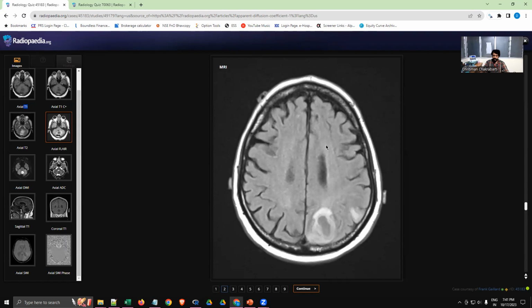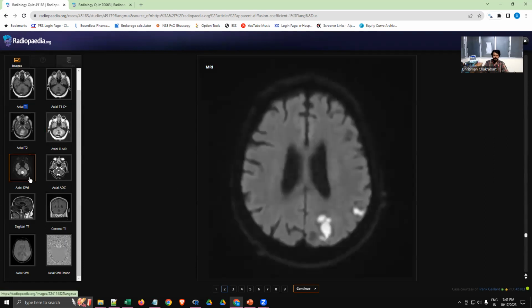Okay, so now you are understanding the importance of FLAIR, in which edema is visible very nicely. Okay, now let's look at the DWI images, or the diffusion weighted images. In diffusion weighted images, the areas which have got diffusion restriction, meaning that water is trapped. Trapped basically means that water is not able to move. The water will not be able to move if it is densely packed because of protein around it, or it is trapped inside a cell. Intracellular water will appear bright white, while the outside cellular water, the extracellular water, which is able to move, will not appear white. Okay. Now, since the number of water molecules is huge inside each voxel of this image, it is basically an averaged value that you are getting.